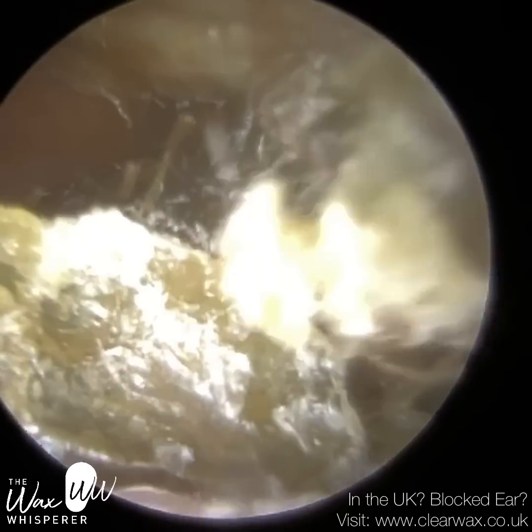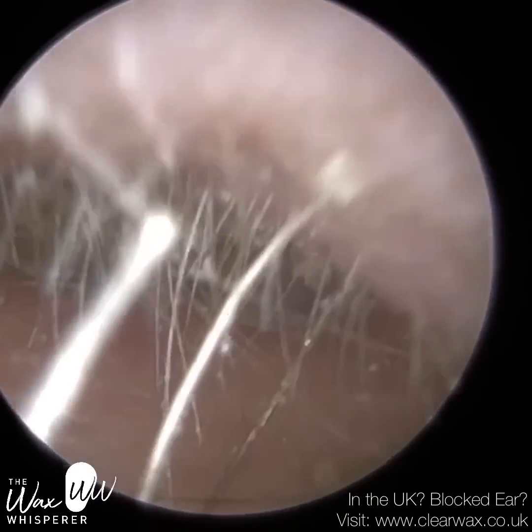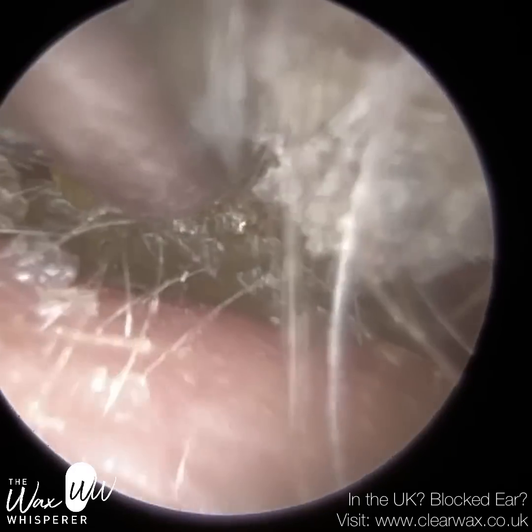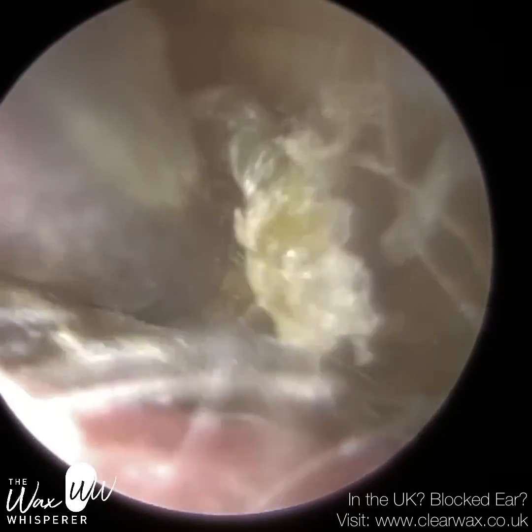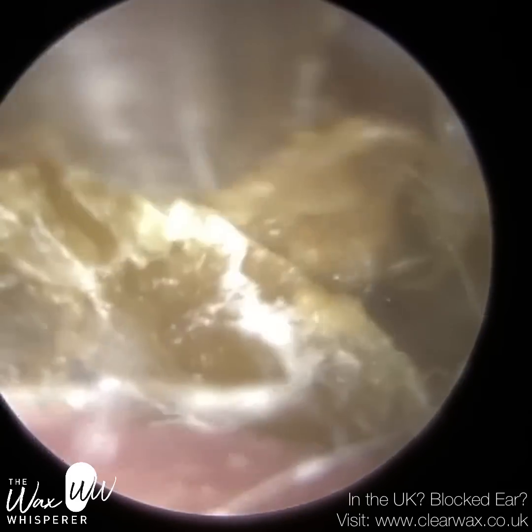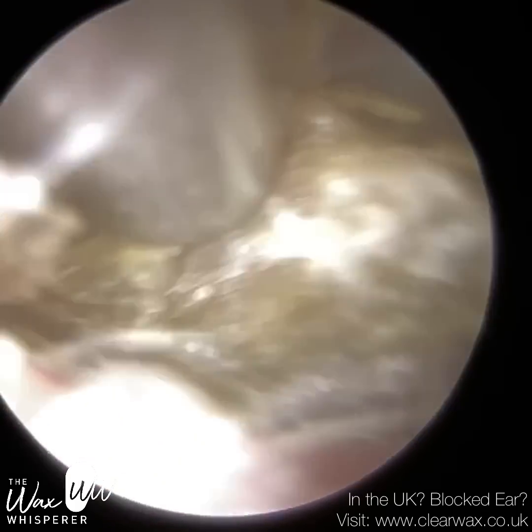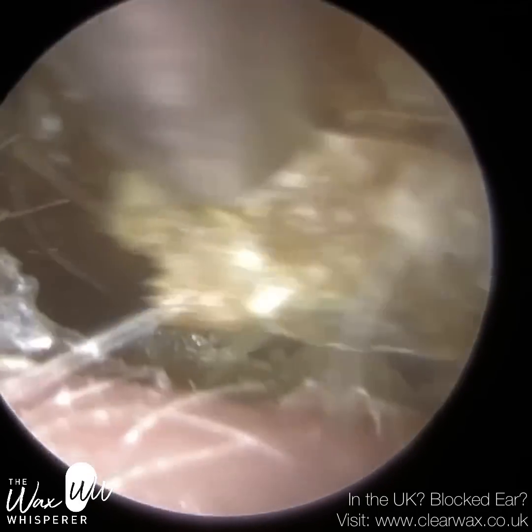They've got this occluding dry skin that I'm just trying to peel away from the ear canal walls. There is also a bit of discharge just at the base of the ear canal, and you'll have a better view of that once I remove this plug. This skin is very crusted and strongly adhered to the ear canal. You can see that even with the sucker and all these wriggling movements trying to dislodge it, it's quite difficult to extract.